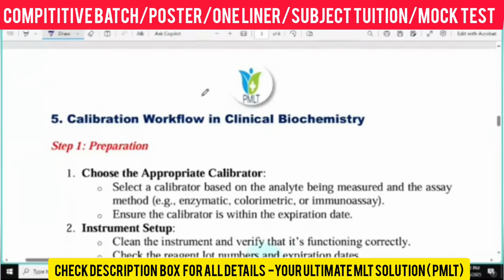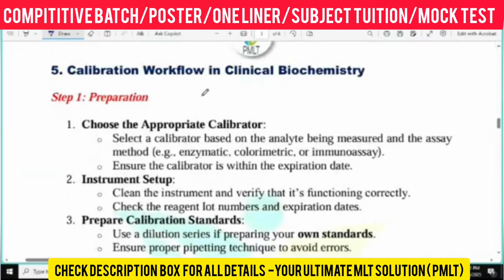See, now we are coming to the workflow, how it's happening. How will the calibration happen, we need to understand.